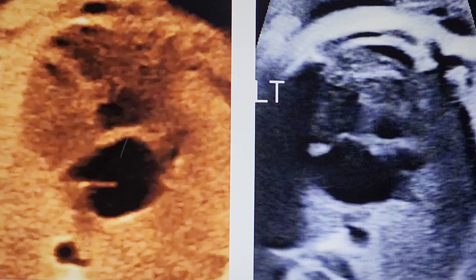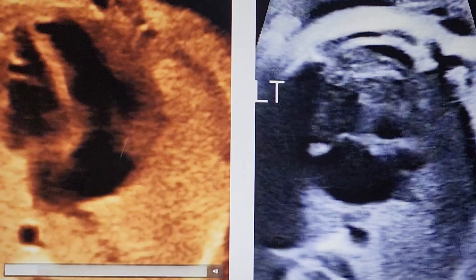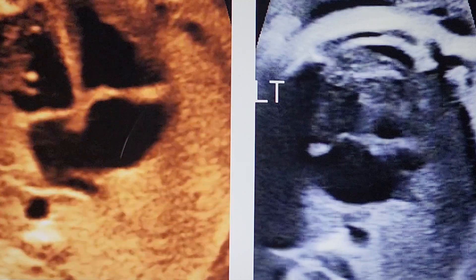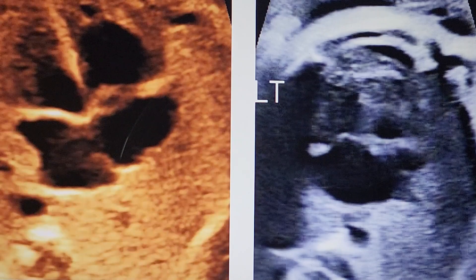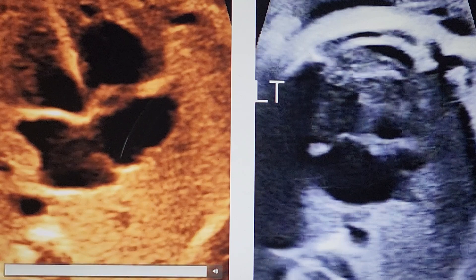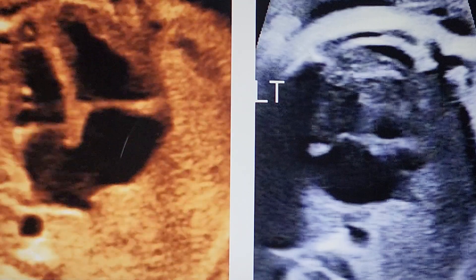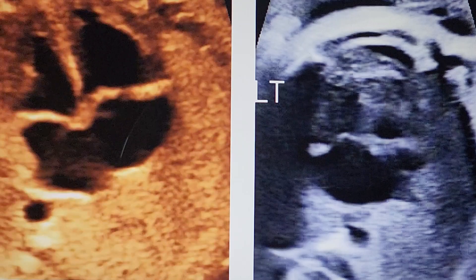Here on the left side I am going to run a four-chamber view in sepia. You can see that the apex is pointing to the left — that is the four-chamber view. The four chambers are of approximately equal size and showing good contraction, which is called the squeeze. The position of the heart is normal. There is levocardia with the axis pointing to about 30 degrees from the sagittal plane, and the apex is formed by the left ventricle.